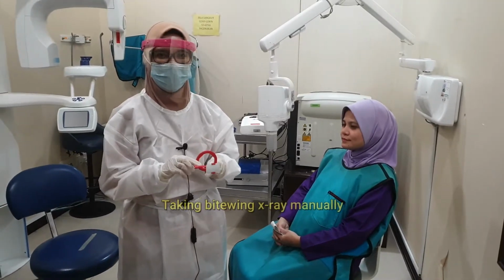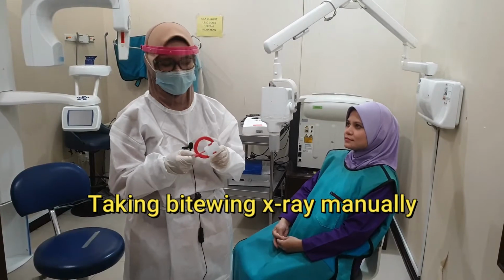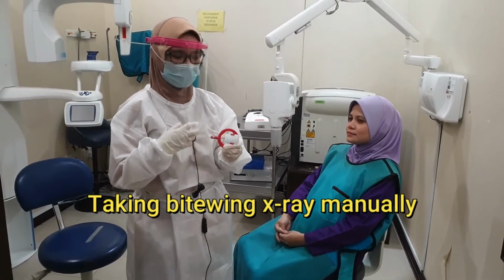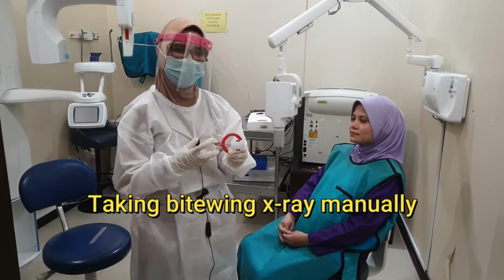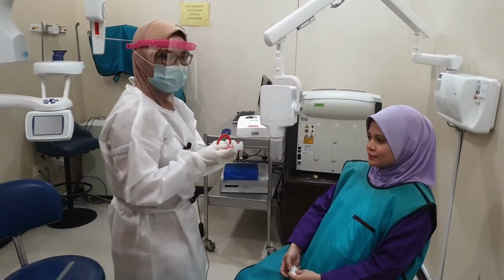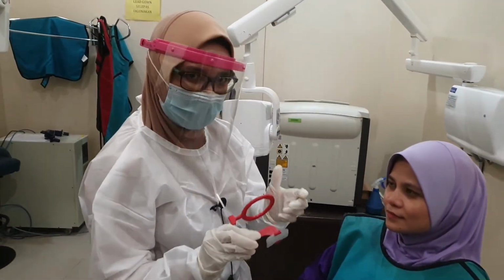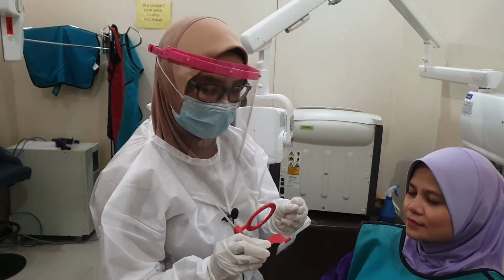I'll now show to all of you how to take the bitewing x-ray. When you have assembled the x-ray holder, now it's time to place it in your patient's mouth. Okay, ask your patient to open as wide as possible.